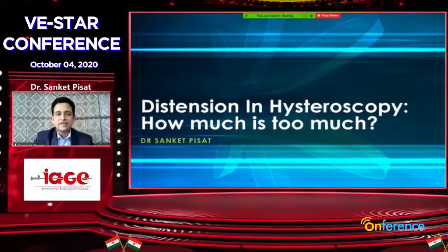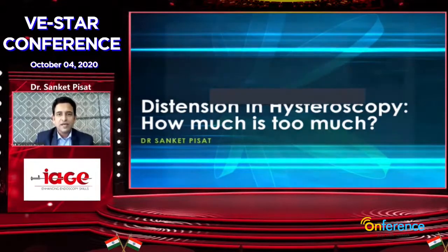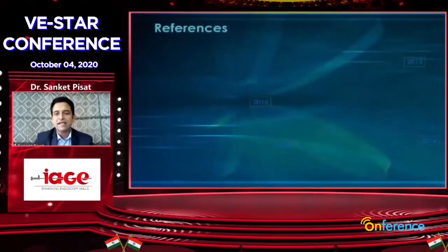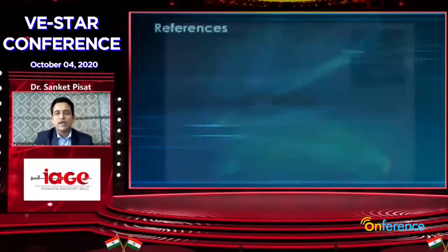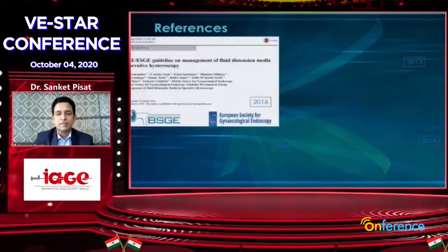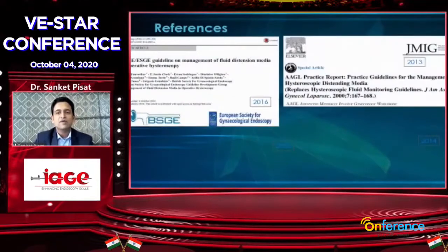So we are starting with this rather odd topic of discussion: distension in hysteroscopy. How much is too much? Now, if we were to answer this question in one single word, the answer would be about 100 millimeters of mercury. But since the answer is not so simple, I've tried to put together some of the most recent references that cater to this particular topic before I give you my opinion of how the magic figure of 100 millimeters of mercury is reached.